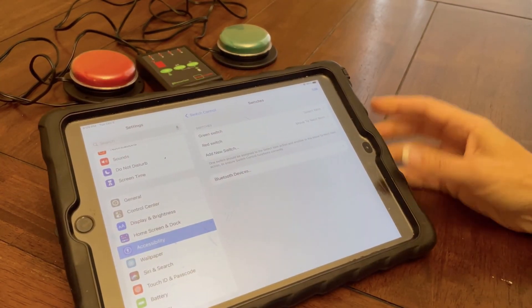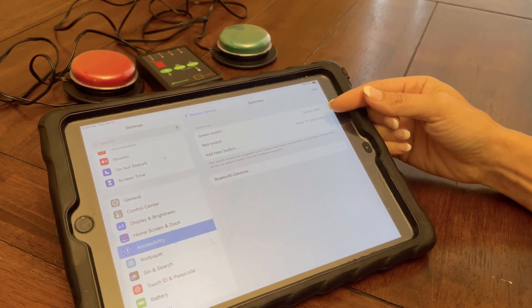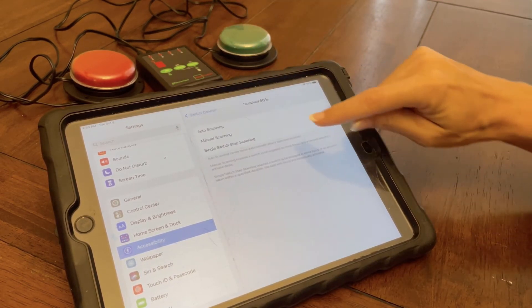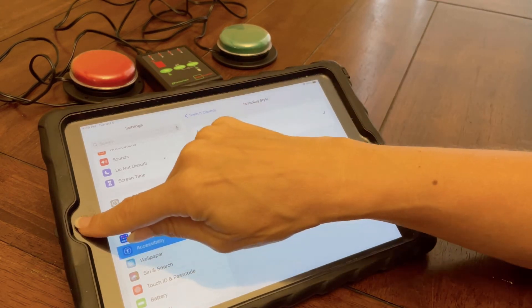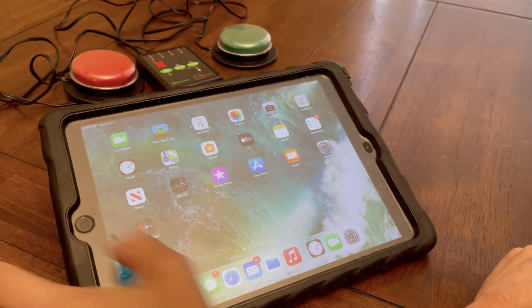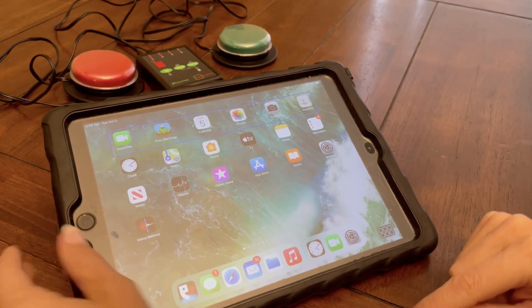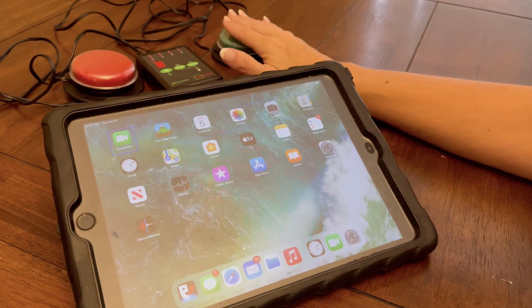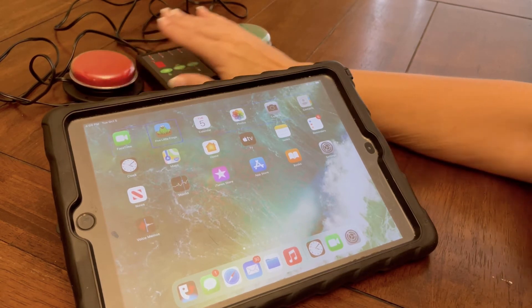With the switches set up to move to the next item and select an item, I can go into Scanning Style and click Manual. I can triple click when I'm in the iPad and use the switch to move to the next item and select.